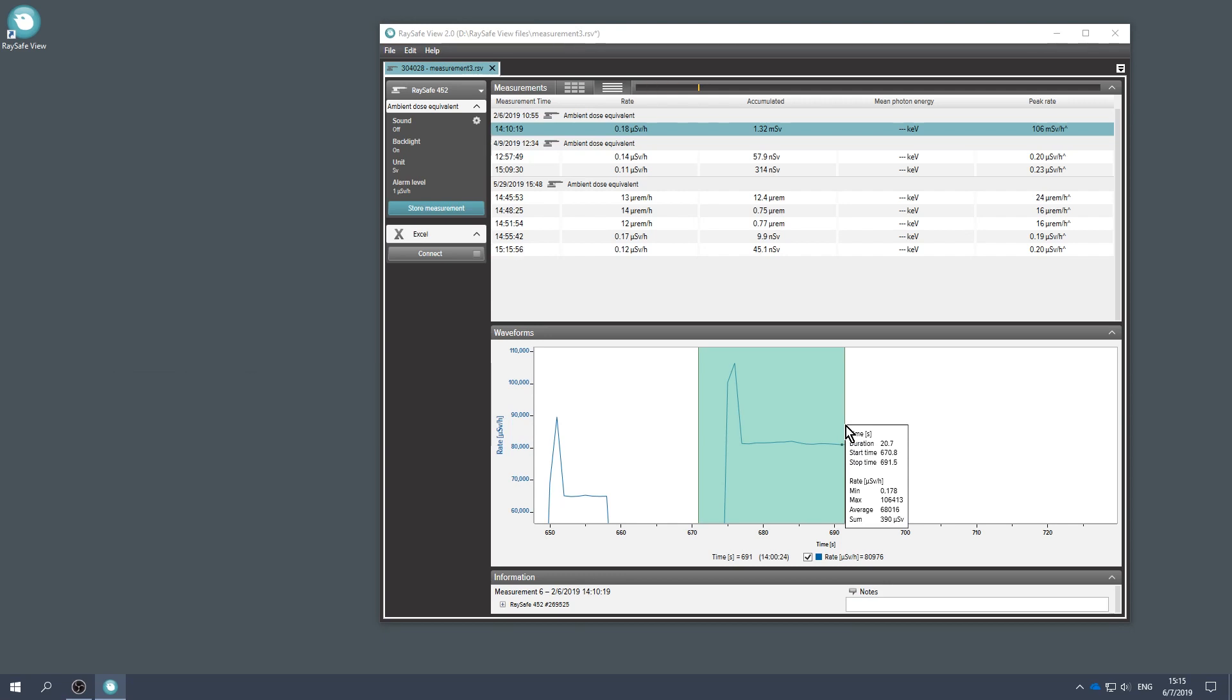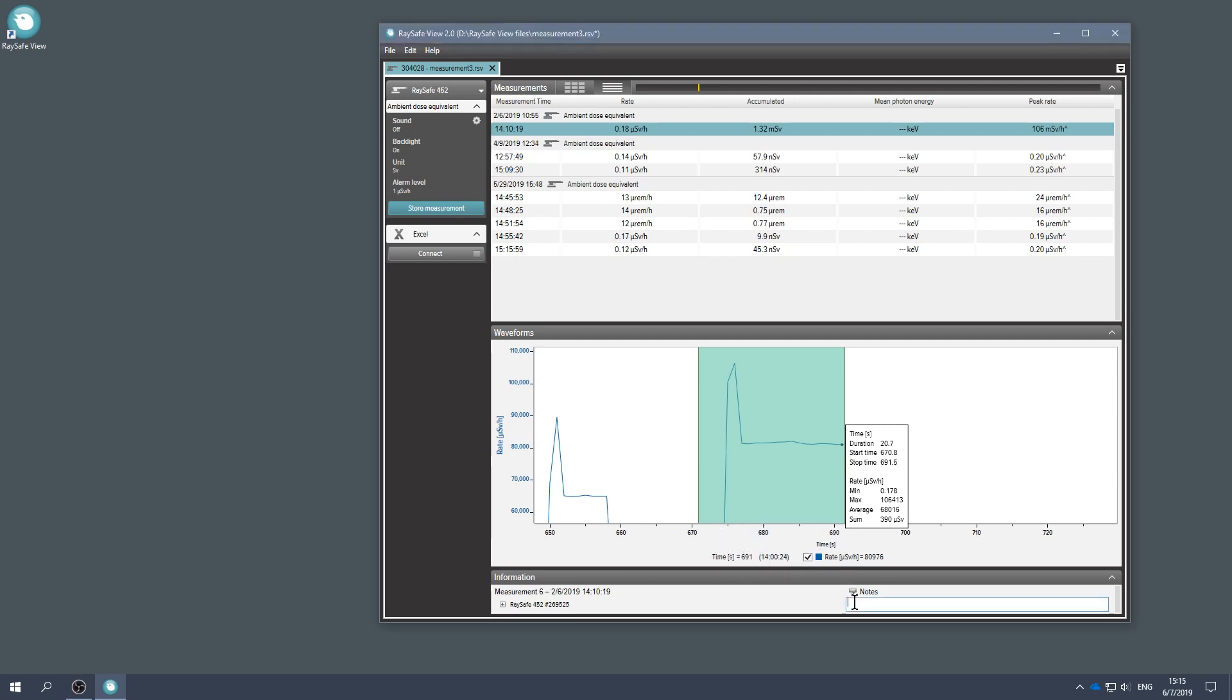You can also add notes to the measurement. The notes are saved with the RaySafe View file.